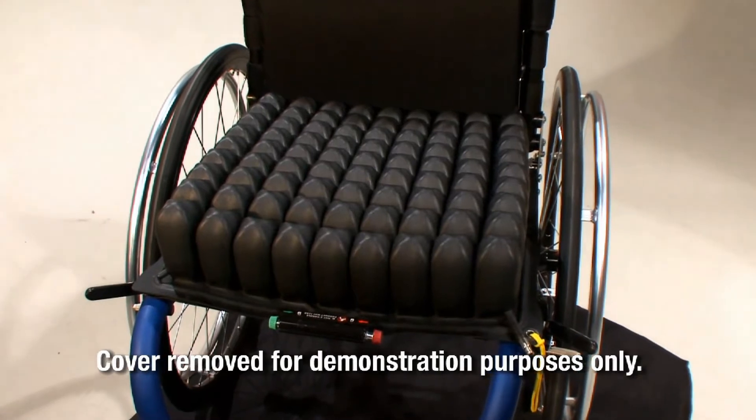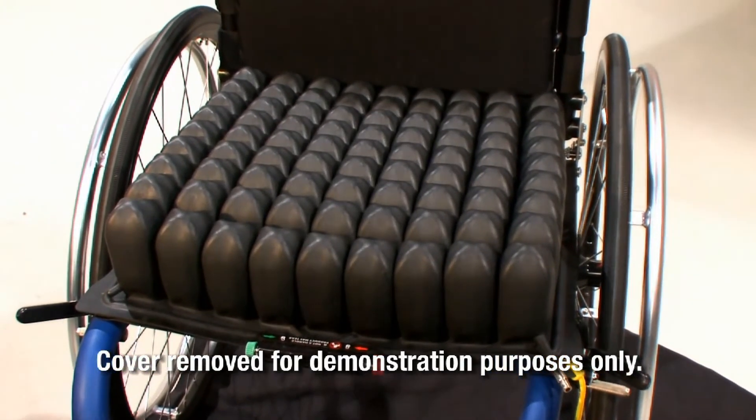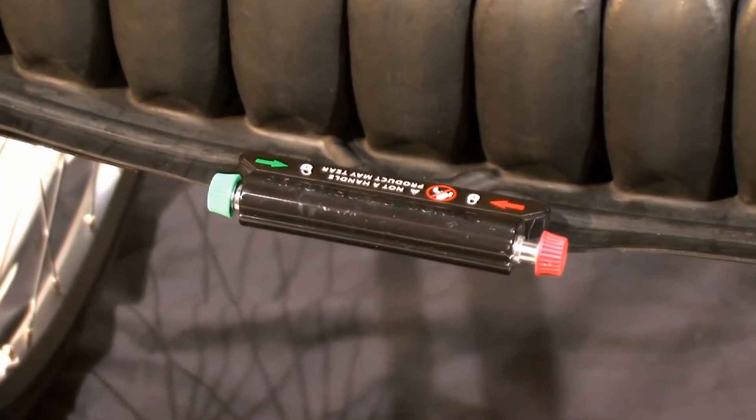The QuattroSelect cushions are divided into four quadrants, or chambers, that allow you to control the arrangement of the air within the cushion. The Isoflow memory control on the front center of the cushion is what allows this.